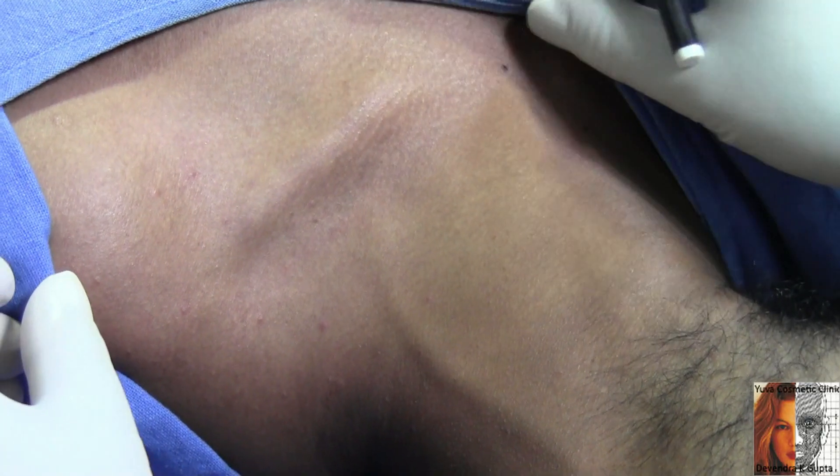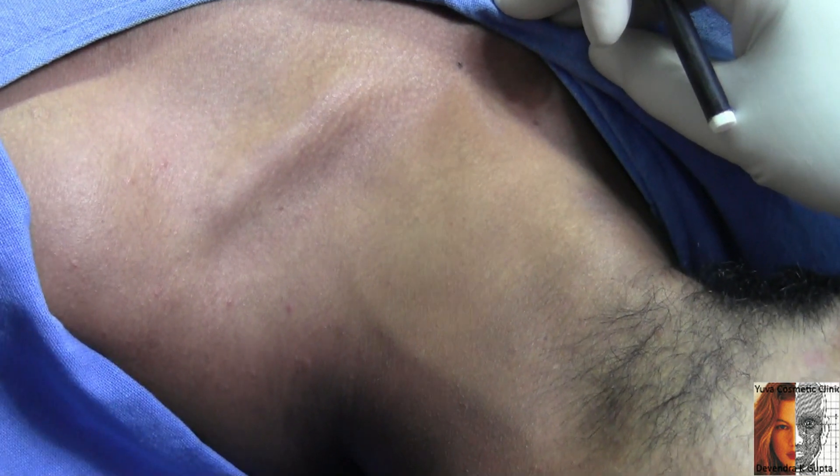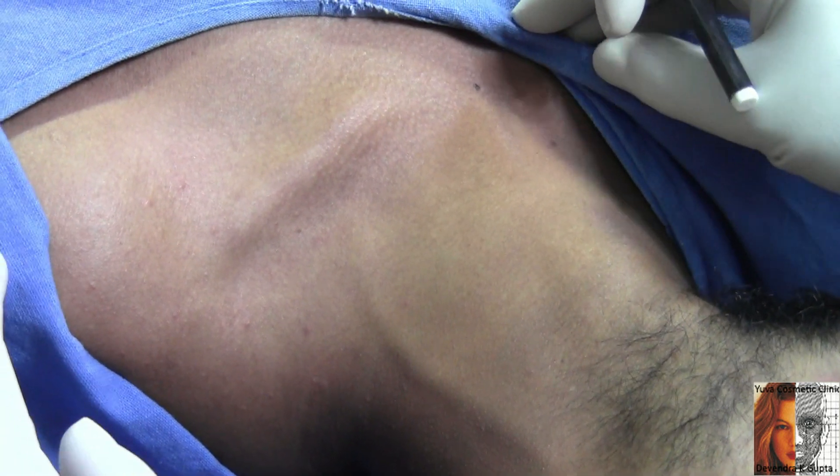This young patient is 22 years old and he sustained a crush injury in his left ring finger. I am planning to give a brachial plexus block.